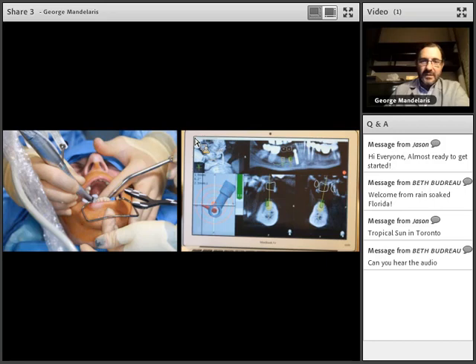You'll notice here that I'm almost 2 millimeters off of the entry point, while my angle deviation is around 6 degrees, and I'm 2.5 millimeters from the apex of that osteotomy site preparation. So I better change things. And it's nice to know that I need to change things now while I still have a chance to do that and before the implants are in place.